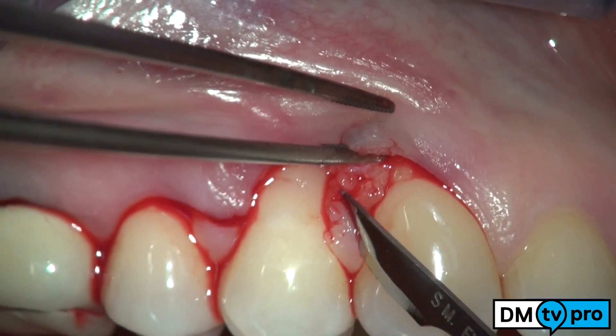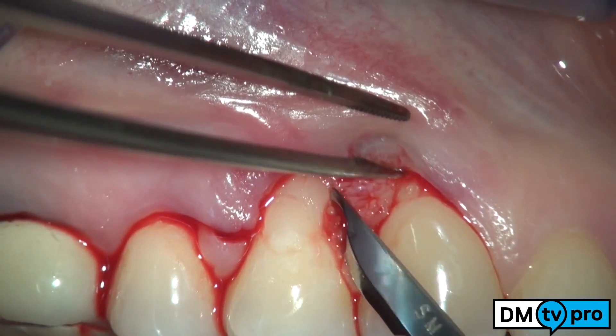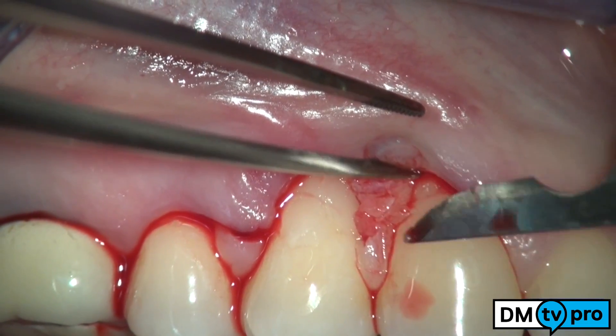The de-epithelialization of the papillae is performed with the 15C blade in order to prepare a connective tissue surface.